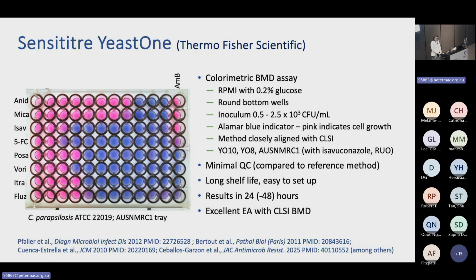I was going to say that if you had isolates that had been tested using Vitek 2 or eTest, or perhaps hadn't been tested at all among your Candidemia isolates, then you could consider referring them for testing. But just before lunch, Abby said there will be no referring of isolates, so I'm not going to say that.